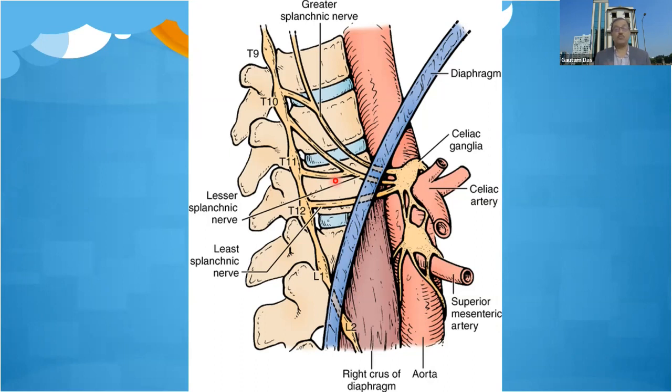This is the difference. I'll be showing you both the celiac plexus block as well as the splanchnic block. I'll also be showing you all the different types of celiac plexus block. And I'll also be demonstrating our modified technique, which was published in 2009.